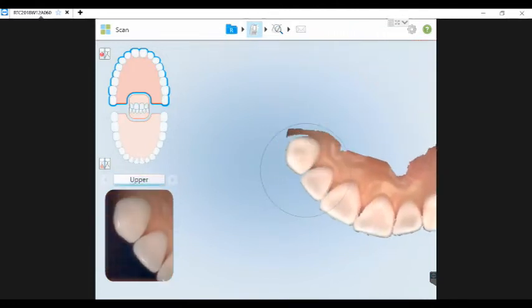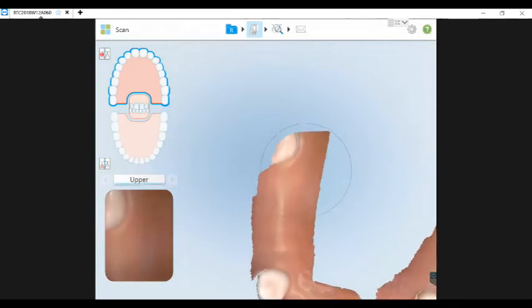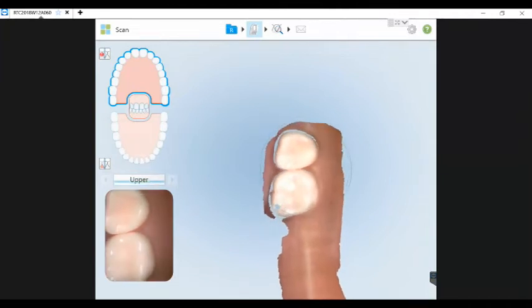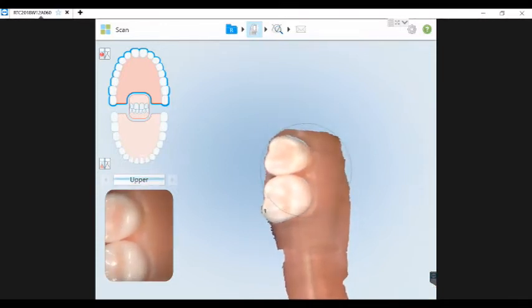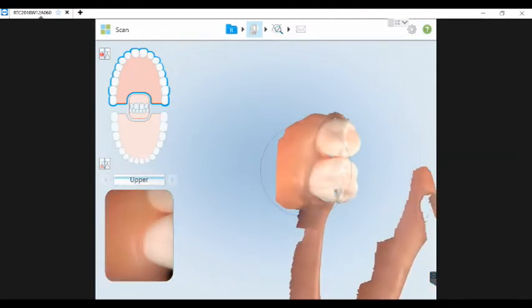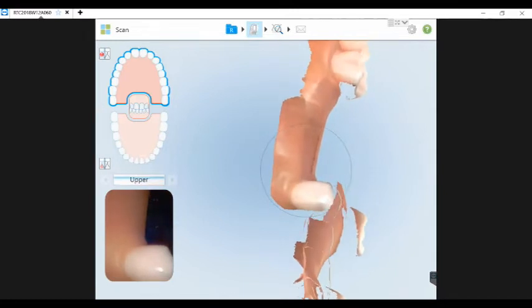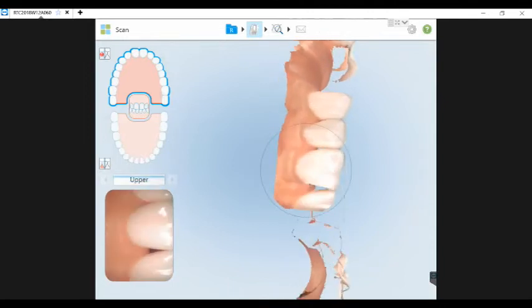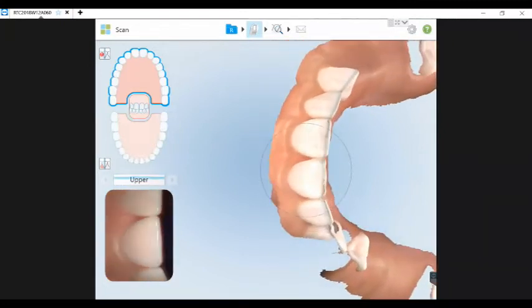And you're still going to stick with the occlusal, lingual, buccal scan path protocol that you ordinarily do with iTero. Sometimes with partials, you need to go a little more lingually than you ordinarily might if there's a large span of edentulous tissue. Some people like to activate or disable the AI for removable partial dentures. I'm personally not as much of a fan.